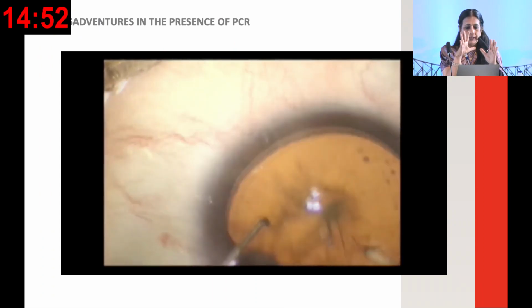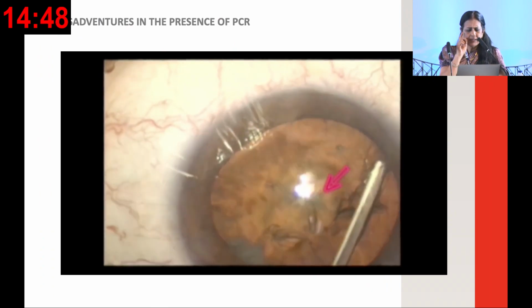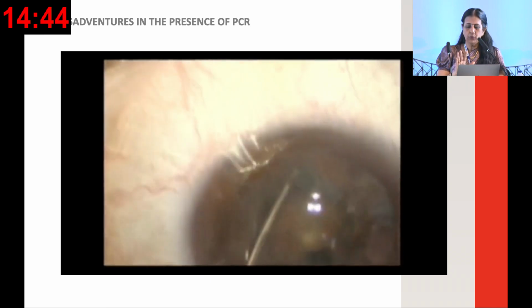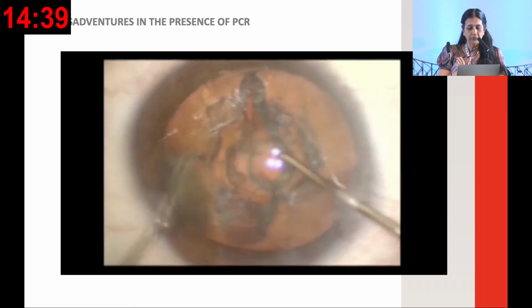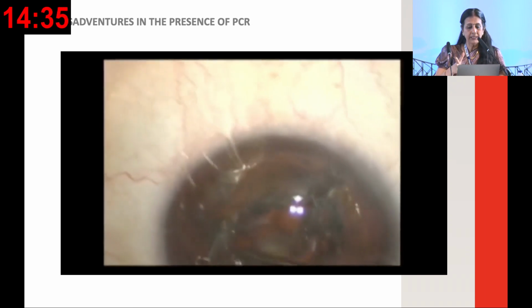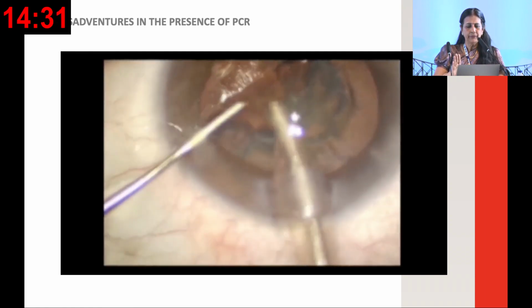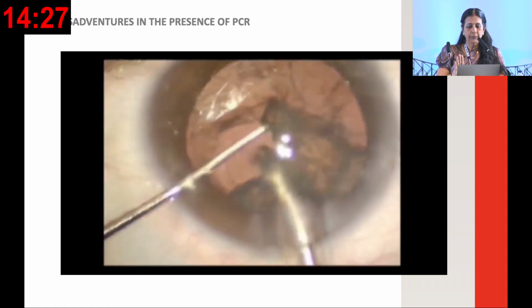Essentially, the first one is an older video. It's a well-dilated pupil which you're seeing here. I have got a decent rhexis. There's a suspicion that there is some kind of a polar element, but I'm able to rotate the nucleus and chop it, and I made a trench here. I feel there's a red glow and followability, which means there's nothing wrong, and everything looks fine. So I'm able to easily rotate, and there's no vitreous here.